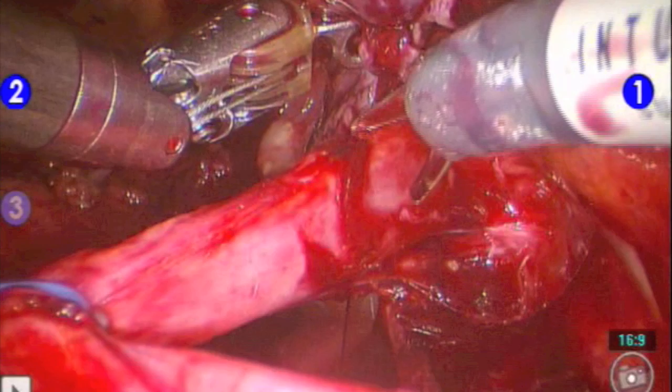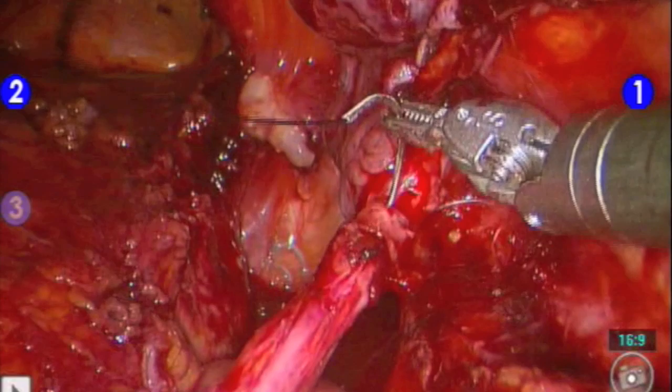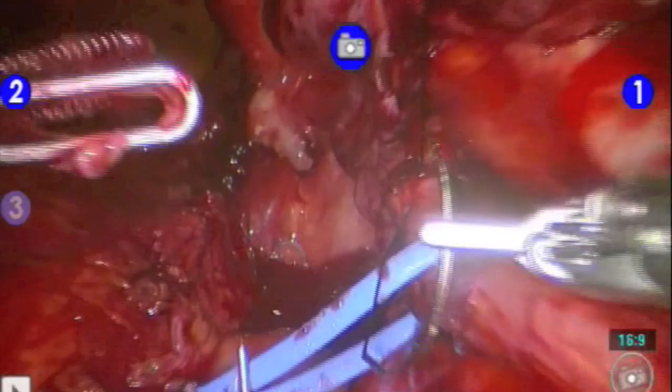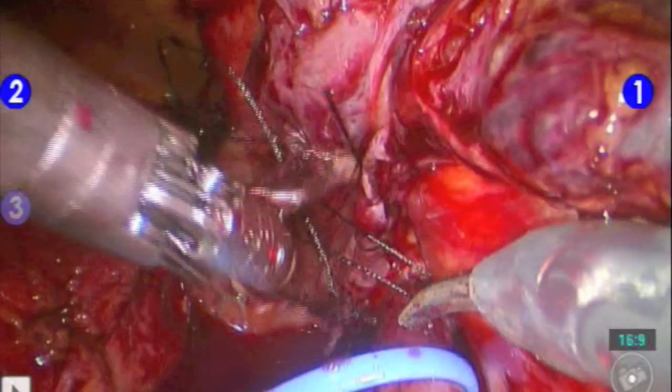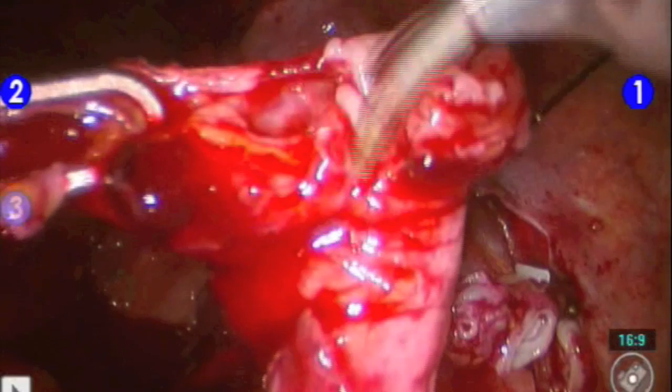A partial transection of the ureter is made, after which a silk suture is passed to create a handle for use later in the operation. Ureteral transection is then completed and the ureter is spatulated for future anastomosis.